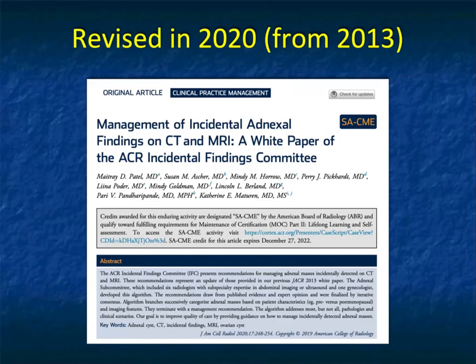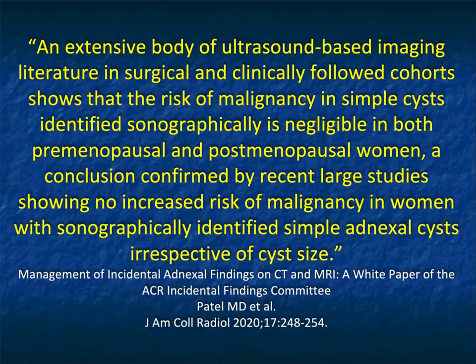So there is a new white paper in 2020 talking about incidental adnexal findings on CT. It's worthwhile reading. Again, the question is the ability to separate those lesions which can be left alone versus those lesions which would need to be followed.